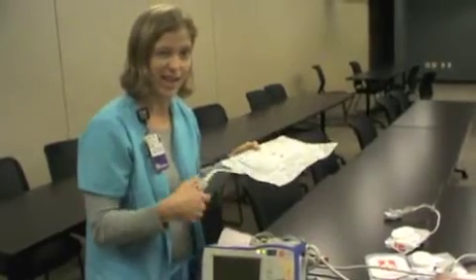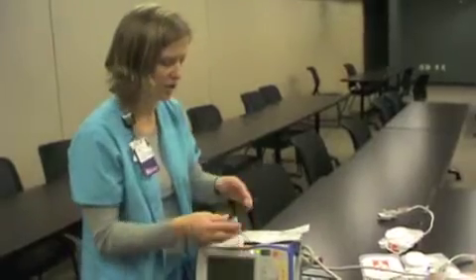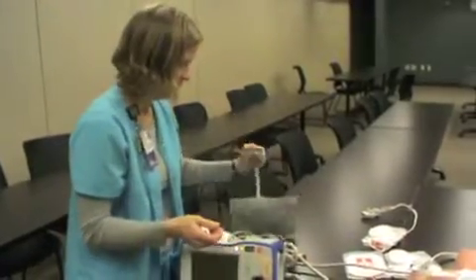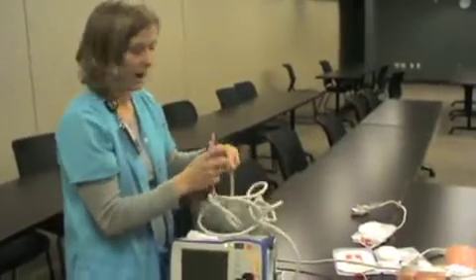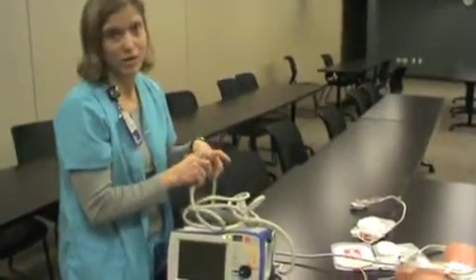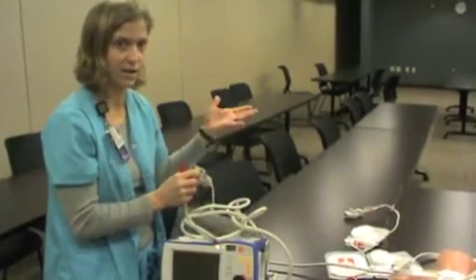It will also do the daily defibrillation check, so no more having to check our defibs by plugging into that little box and checking a defibrillation charge into that. So instead, we just leave our therapy cable plugged into pads all the time, and every morning at 3 a.m. it will just by itself deliver a shock into there of 30 joules and continue on its way.